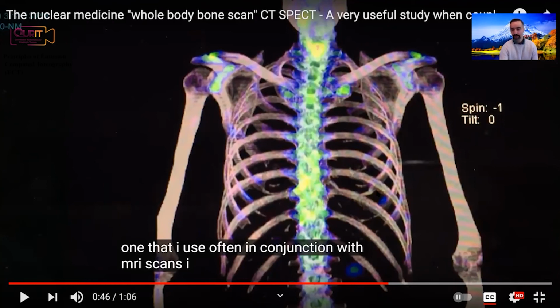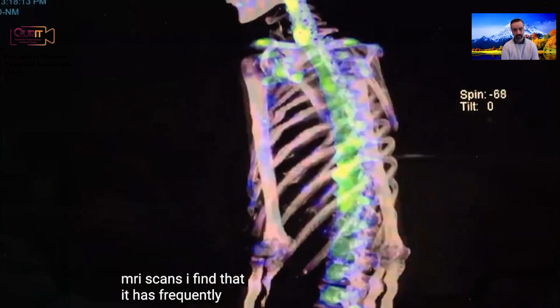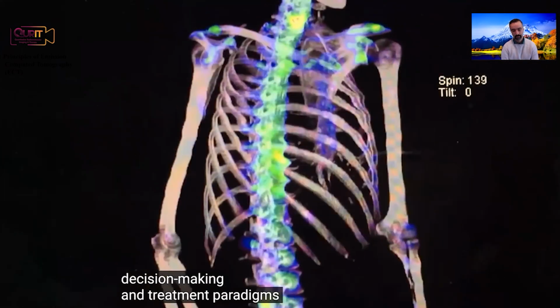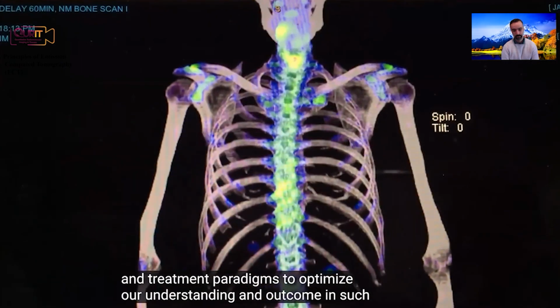So it's anatofunctional imaging. They're fused together. So again, by looking at these two kinds of images, fully registered and naturally registered because they're on the same scanner, the clinician is able to diagnose and assess disease much better. I find that it has frequently guided clinical decision-making and treatment paradigms to optimize our understanding and outcome in such patients.